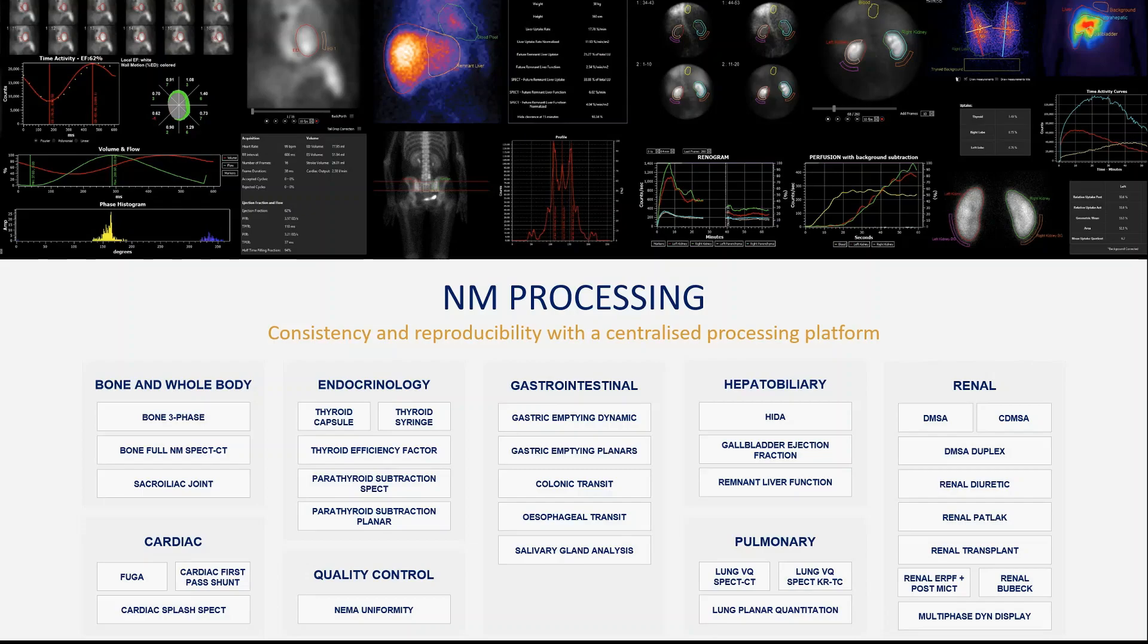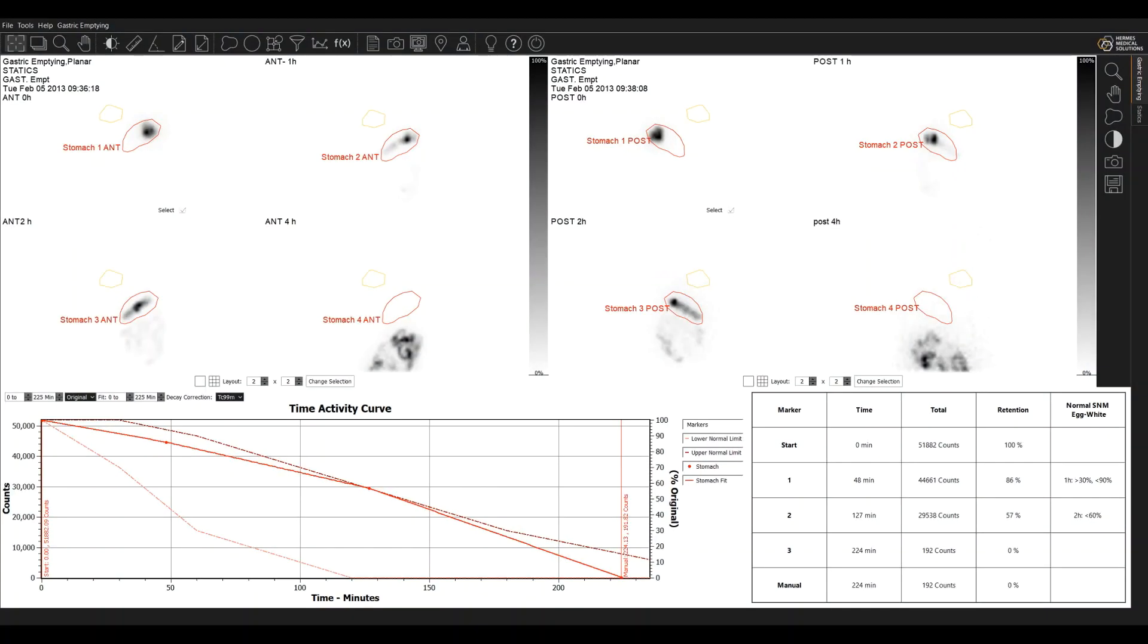Looking now at the gastric emptying application. This application can take static or dynamic or both acquisitions. The regions can be drawn on any of the views and then aligned as necessary on the others. So we have anterior and posterior images for this patient. The time activity curve is displayed down here.